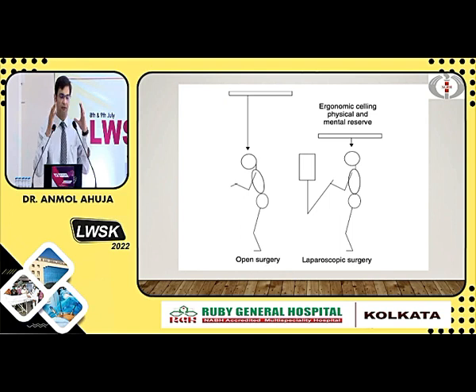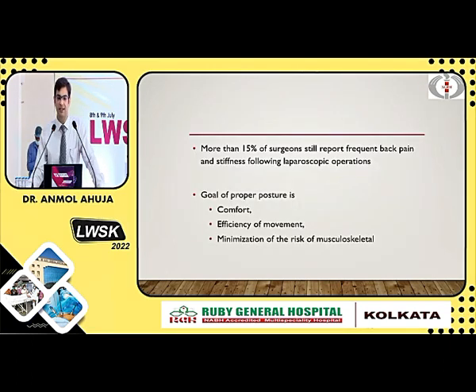In open surgery, it is usually a reflex that once we are operating, we start moving around. Our weight will be on one leg, sometimes on the other leg. But it's not so common in laparoscopy. Usually we stand stiff, and since we have to operate a lot of things from the pedals, that leads to a different kind of posture, which is a little more difficult than open surgery. More than 15% of surgeons still report frequent back pain and stiffness following laparoscopic surgery. The goal of a proper posture is comfort, efficiency of movement, and minimization of the risk of any musculoskeletal injury.